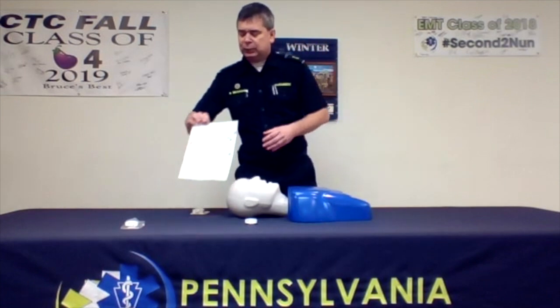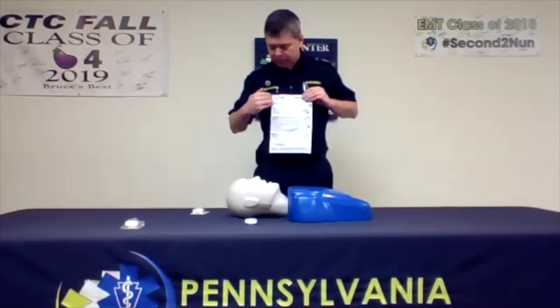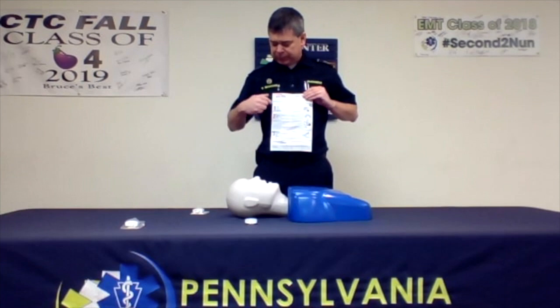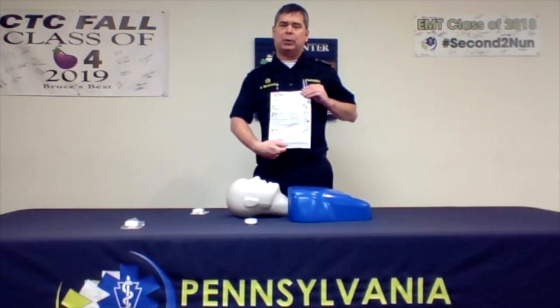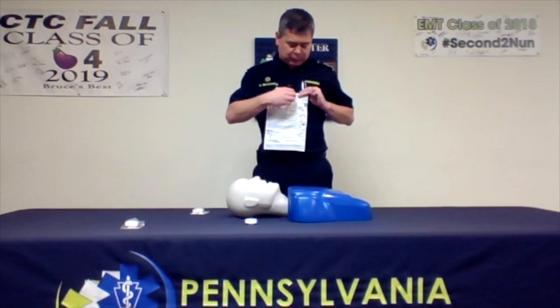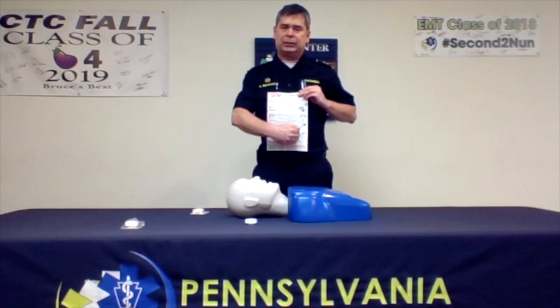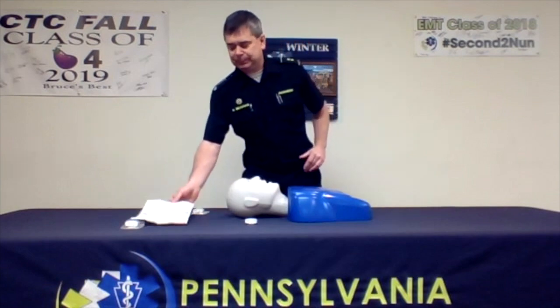For those who require instructions, every pack comes with its own instructions. To the right, we have large bold print, small instructions that are lettered and numbered. In the center, there's more accurate and more descriptive. And of course, for those who have reading difficulties, there are pictures on the side as well that'll help you with administration. Let's get down to it.